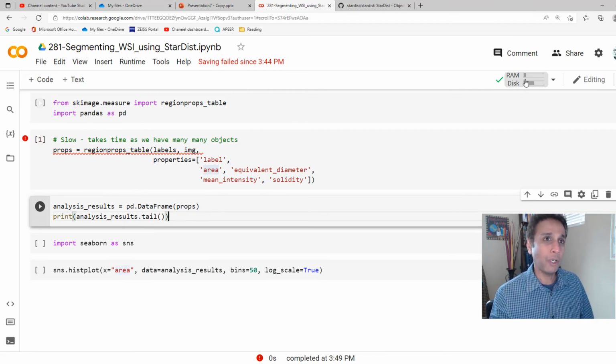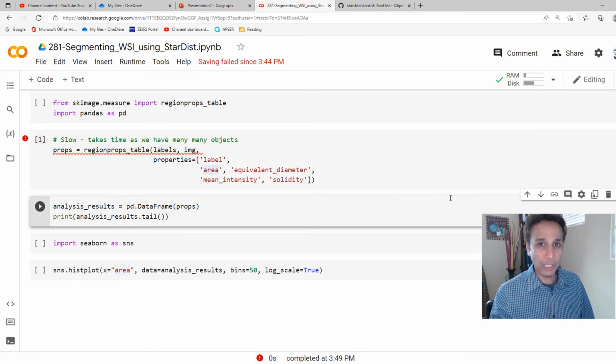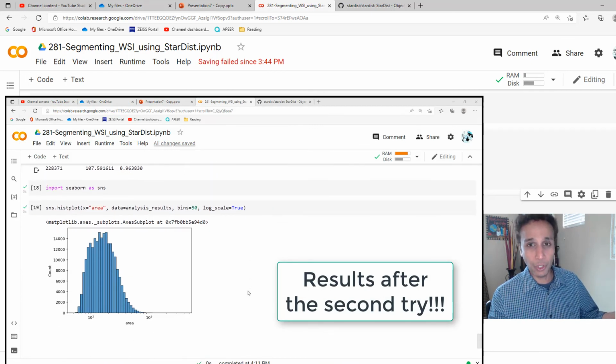It all depends upon what's available RAM right there at the time you're running your Colab, or you can pay for it to get extra RAM. But I did this once. That's exactly why I have extra lines of code. But for whatever reason, it decided to fail on me right now. But let me run this one more time and flash the screen at the end to show you exactly how the result of these would look.